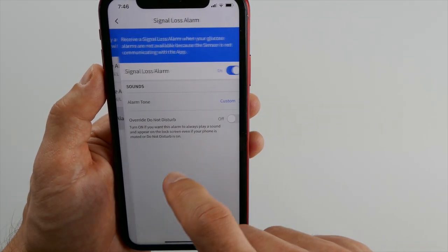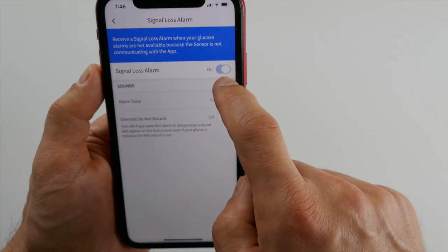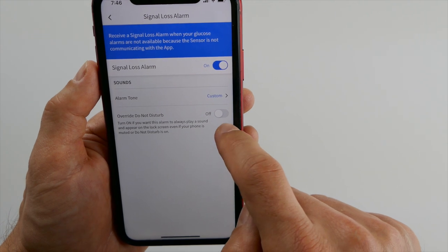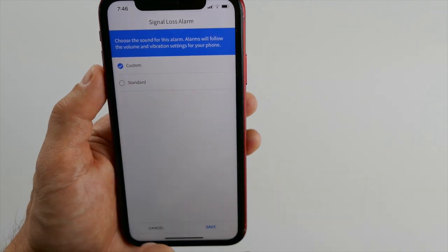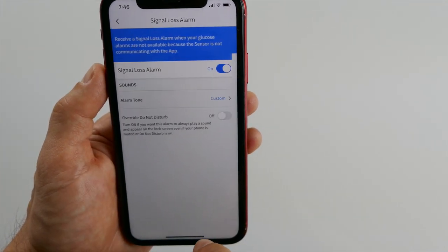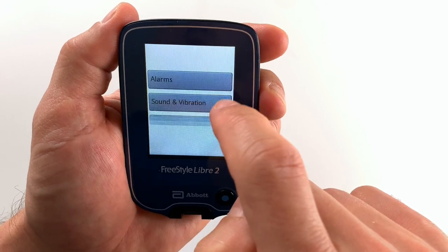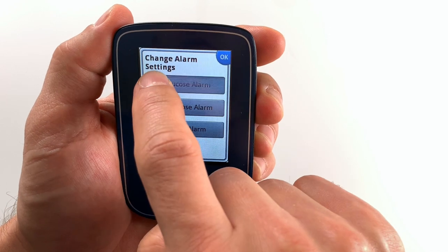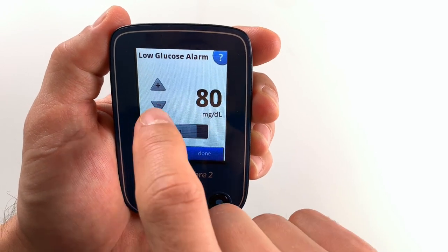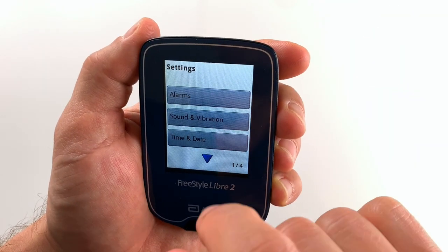The last type of alarm you can get is a signal loss alarm, which will warn you any time your phone stops receiving alarms or when your receiver is too far from you. Because the sensor signal is sent via Bluetooth, you need to have your receiver close enough — ideally in the same room — to not lose the signal. Setting things up on the blue Libre reader is very similar: go to Settings, Alarms, and click on Change Alarm Setting. Here you can activate and set low, high, and signal loss alarms just like on the phone, and you can adjust volume and vibration in the Sounds and Vibration section.